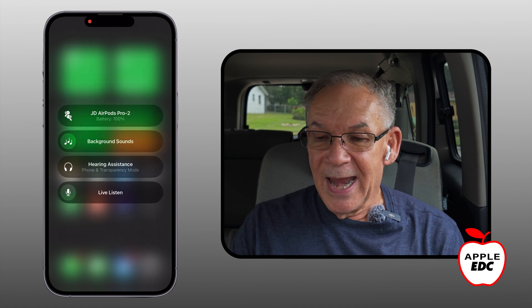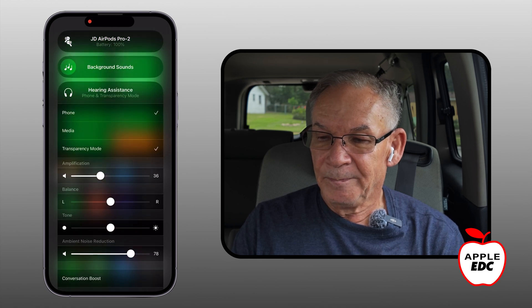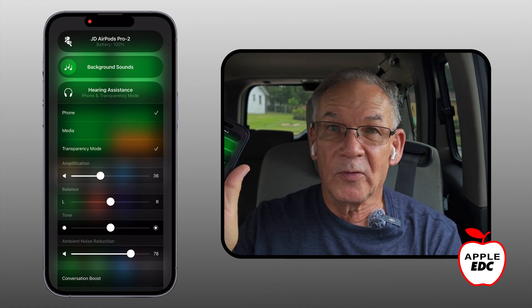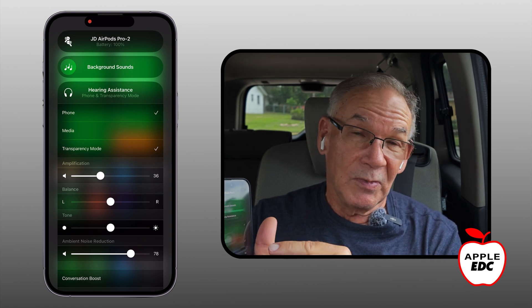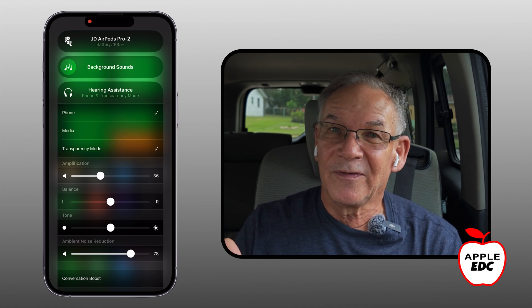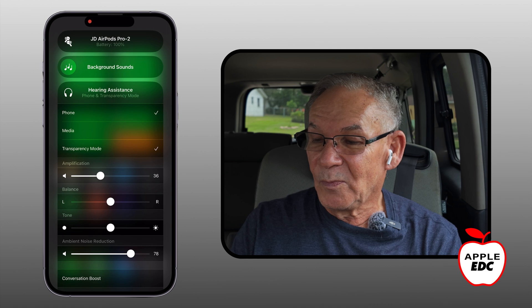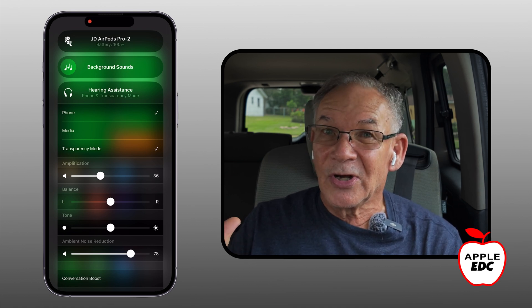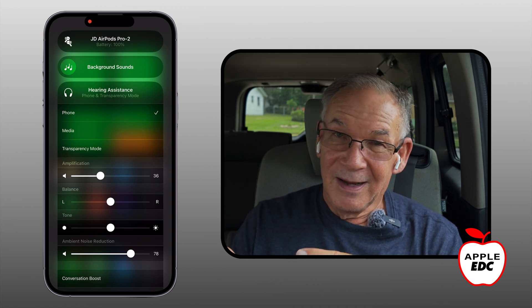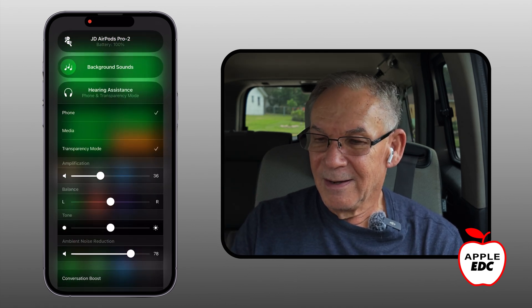Let's tap that. It shows me different options, and one of them is hearing assistance, so I'll tap on that. That opens up an entire menu of things I can do. I can tell it that I want hearing assistance with my phone but not with media. The transparency mode I think is a holdover from the previous version of iOS — it'll probably end up saying hearing assistance, but I'm on a beta version of 18.1. That turns on and off the hearing assistance. Now there's a little bug: if you tap it, it does turn it off but the check mark doesn't go away. If you close the screen and reopen it, you'll see the check mark is gone. I think that'll all get cleaned up in the next few software updates.